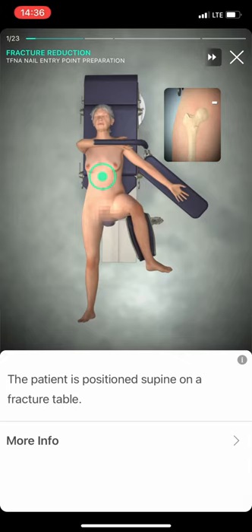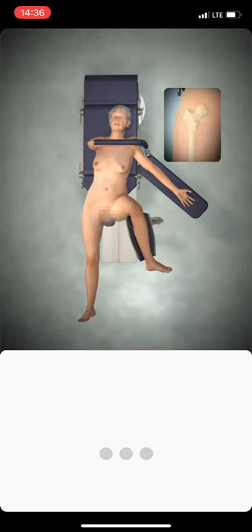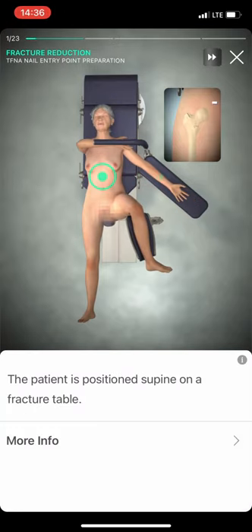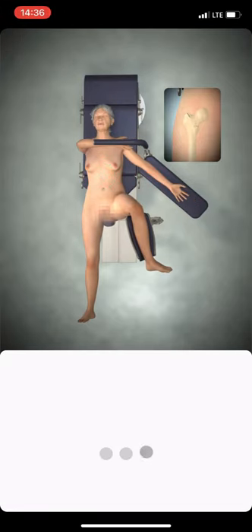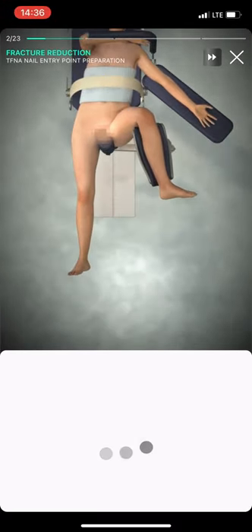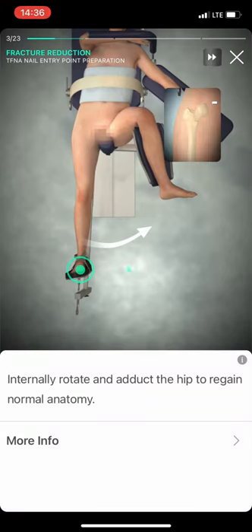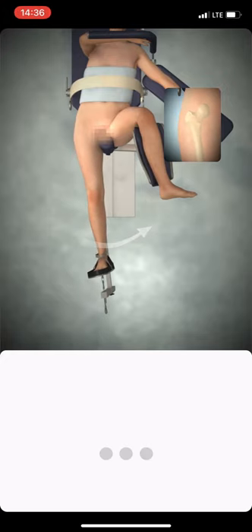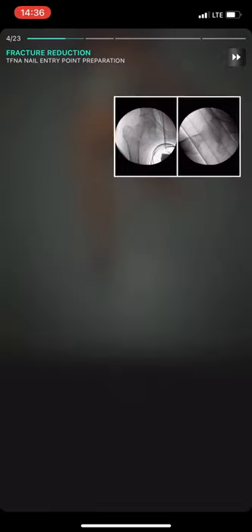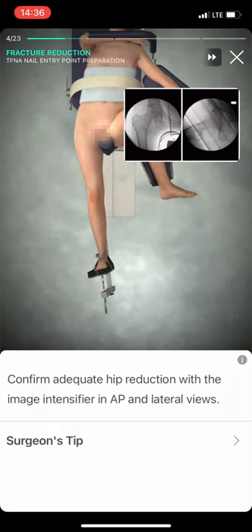Distract the fragments. Internally rotate and adduct the hip to regain normal anatomy. Confirm adequate reduction with the image intensifier in AP and lateral views.